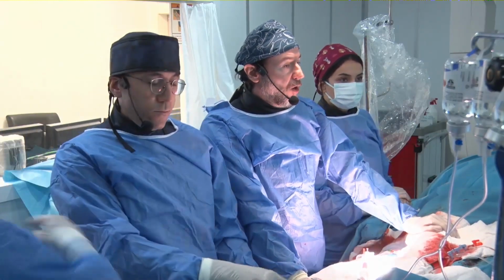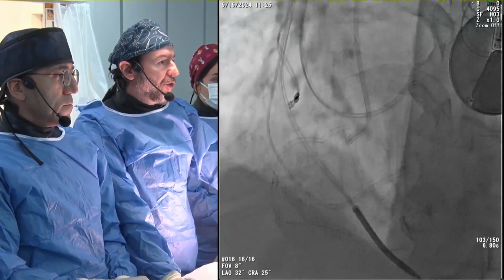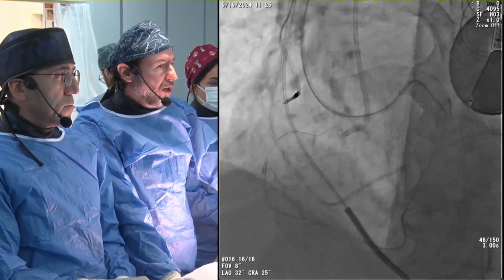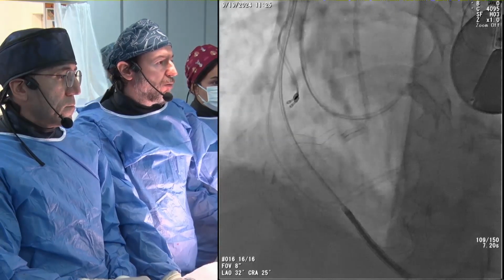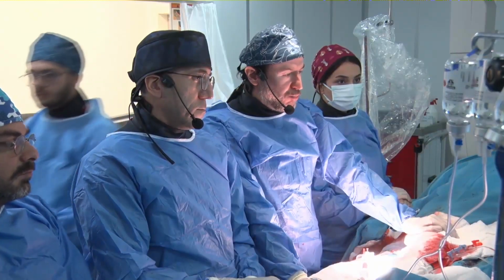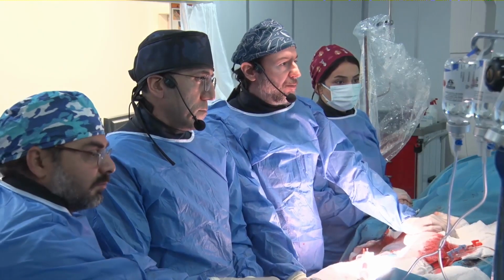We also have creatinine problems. This patient has renal failure. The creatinine levels are under control now, and so far we only used 50 cc contrast. We tried to engage antegradely at least to see the ostium of the RCA, but we couldn't see it clearly. There is maybe some channel, but the engagement is very poor. We don't have any engagement there, and the CT doesn't help us much at that point.